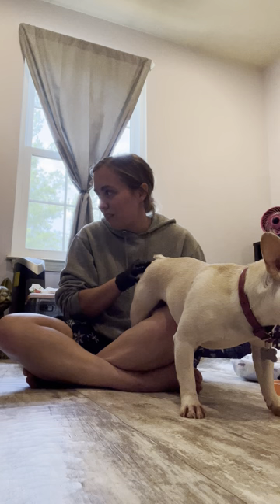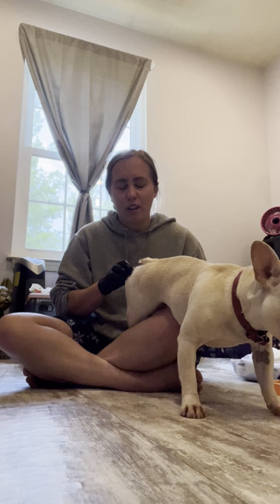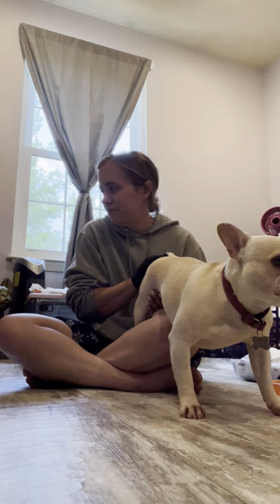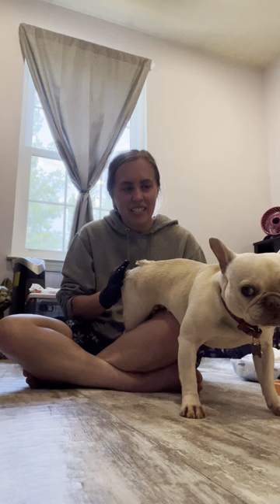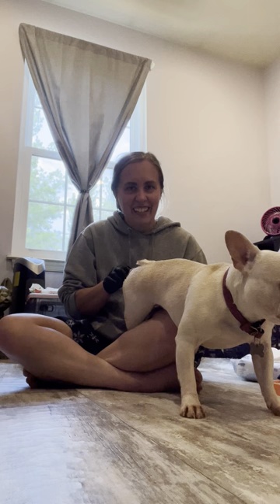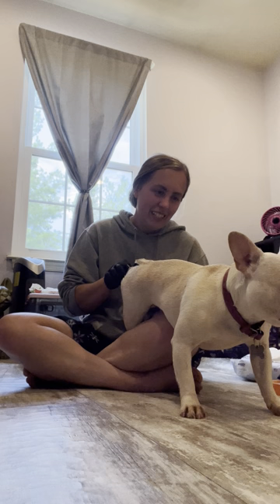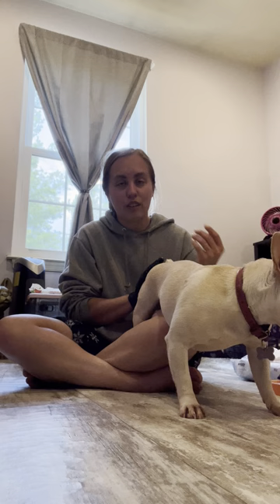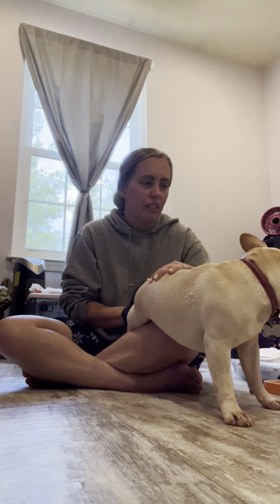Right, Rollo? She bit Rollo this morning and he was very sad. She didn't hurt him or anything — she just told him no. Hi Rollo, you can't have her. She's your mommy. But she's flexing her muscles on me too. I don't know if you can see it. Is it itchy? I don't think it's itchy. You little floppy fish. You're so cute. That's it — that's all you do. As you can see, I take the other glove off just so I can pet her.